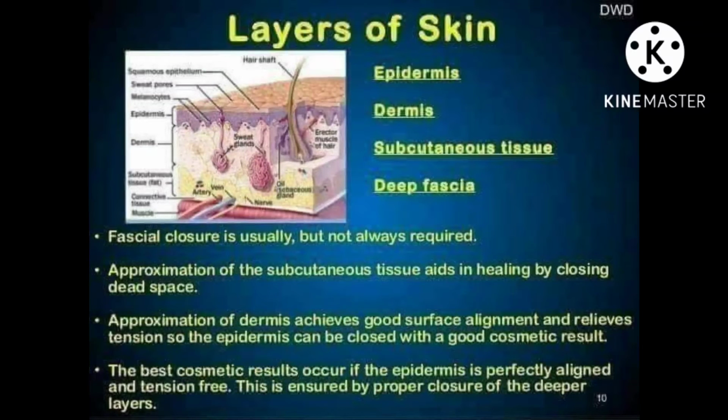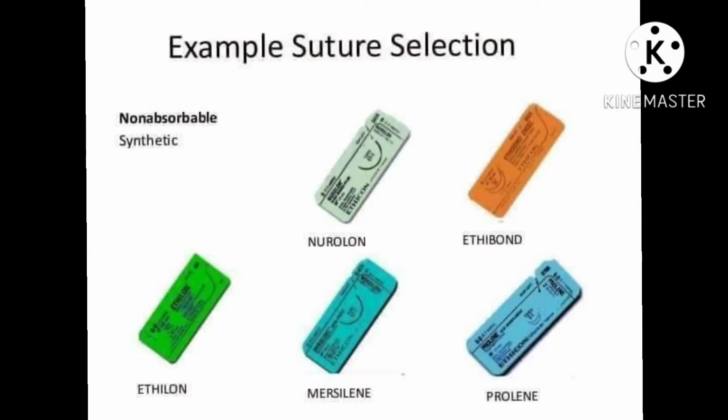Generally, a surgeon uses the smallest caliber suture capable of maintaining tissue apposition. Some sutures are coated to decrease drag through tissue and the coating, although it increases caliber, is not considered while naming its caliber.